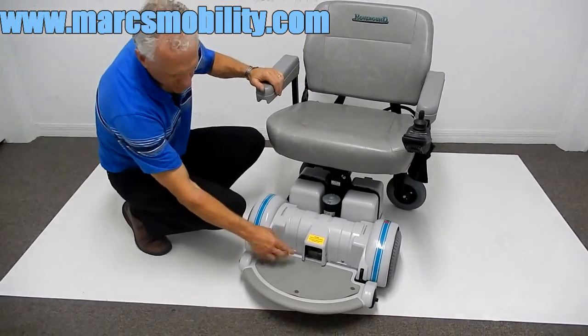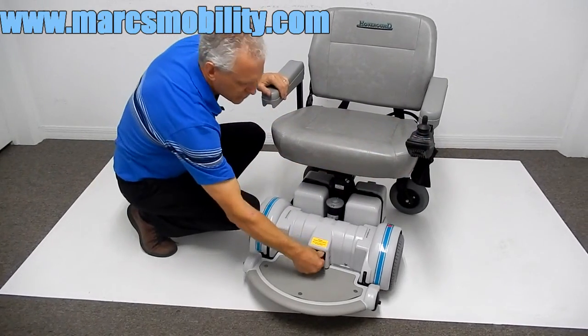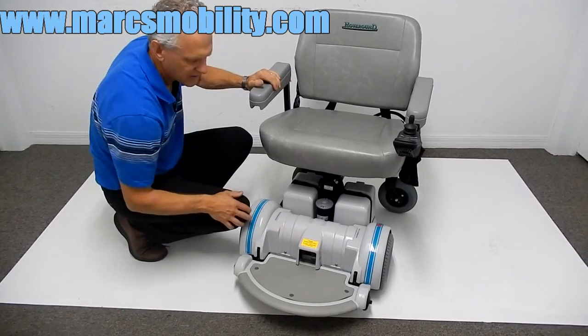If you need to put the chair in neutral, you have two levers here. Make sure your chair is turned off, push your levers down, and your chair is in neutral. Push your levers back up and you're back in drive.